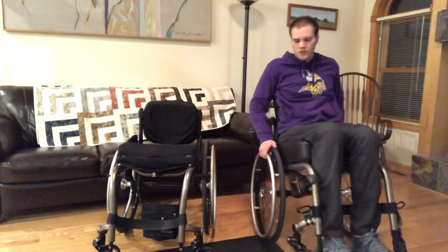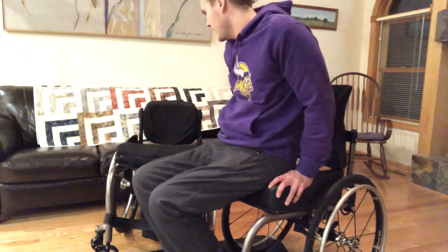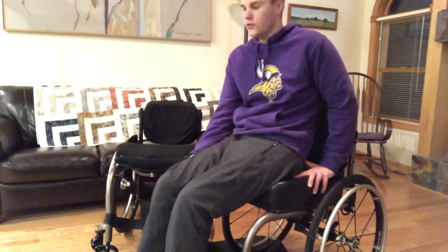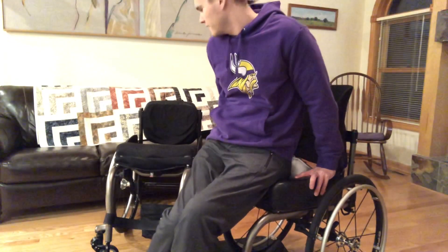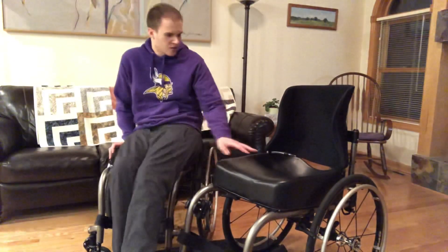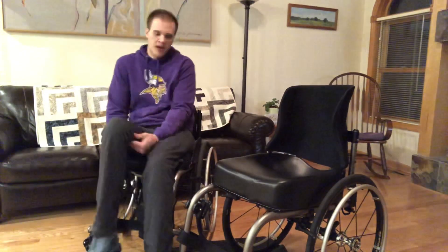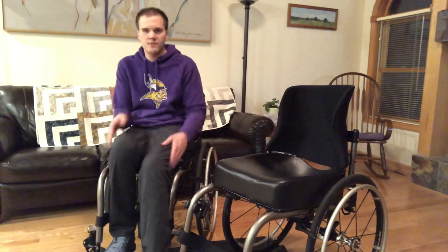I'm going to show you my posture by transferring into this chair, because this has more of a soft, airy Rojo cushion. This new chair's cushion is very custom to my bottom — it's actually lower on one side than the other to balance out my pressure and to also align my hips a little better.